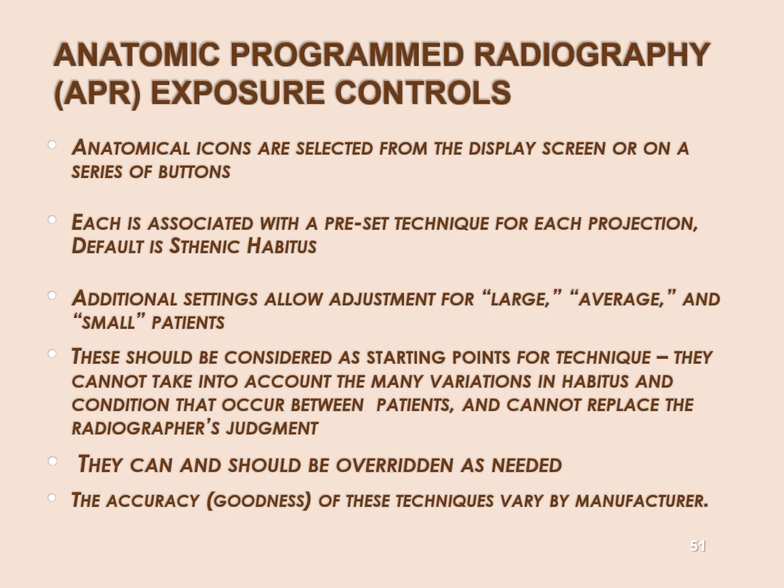APR. Now, Carroll does a great disservice to APR, considering how prolific it is in the modern era. That's because Carroll has gray hair and he's used to technique charts, and a proper technologist will make their own spreadsheet, publish their own technique chart. So only you button pushers will dare to use the APR. How can you trust the machine?